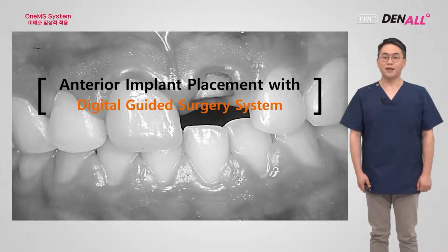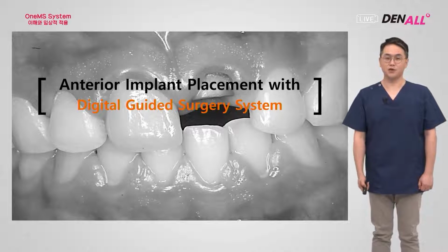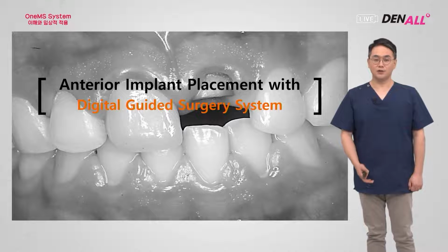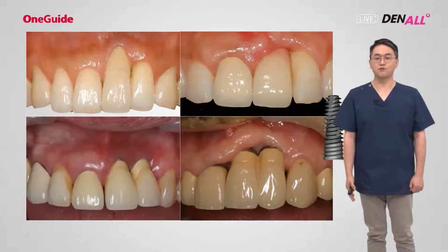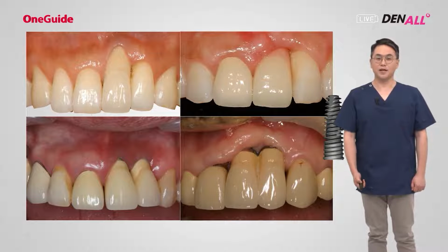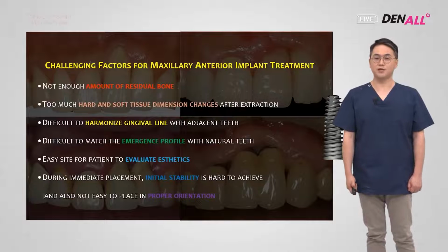First, be it OneGuide or digital guided surgery, I think the easiest case to use is for anterior implant placement. So first, why do you need to use a guided surgery system for the anterior part? As you know, on the upper anterior part, if you position the implant in the wrong position or the angle is wrong, then it could lead to these disaster results. So it's really tricky to place an anterior implant.